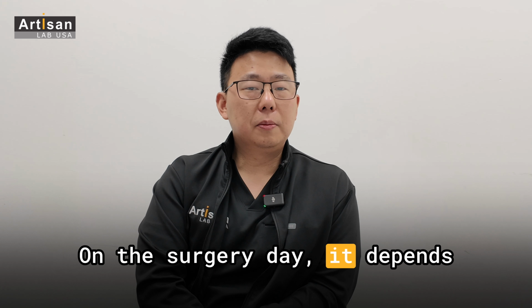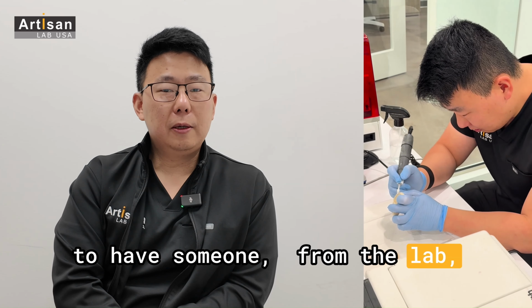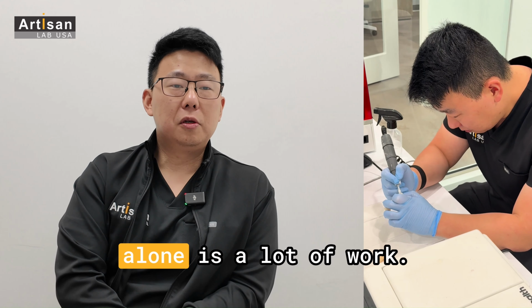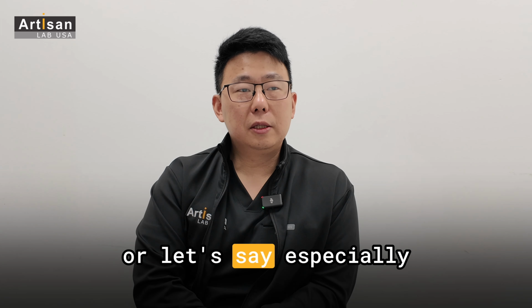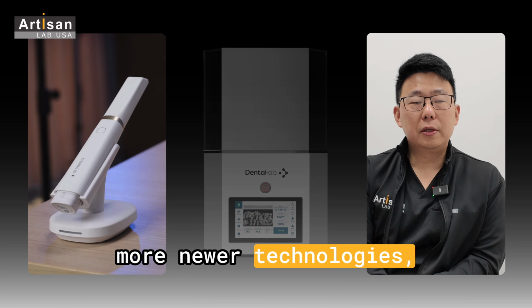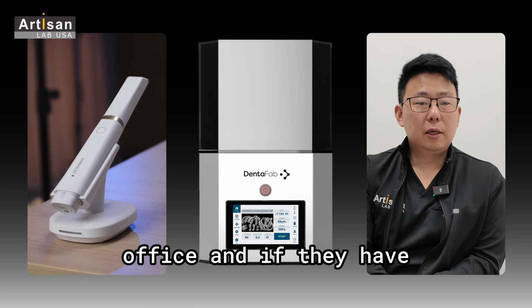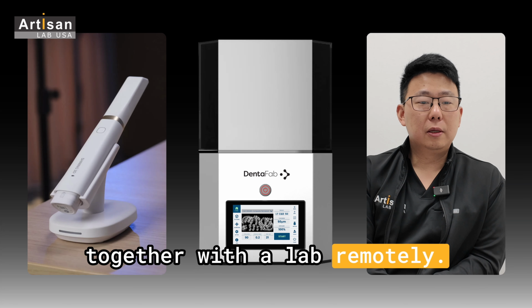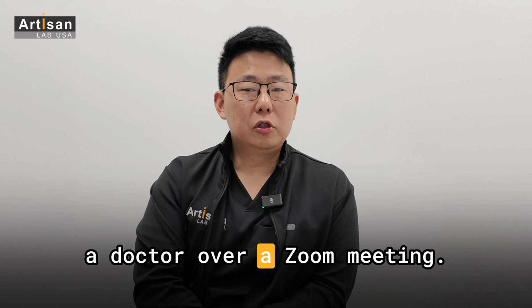On the surgery day, it depends on the doctor's preference, but a lot of doctors prefer to have someone from the lab come out on the surgery day and take care of the conversion process, because surgery alone is a lot of work. But if the doctor is confident, or, especially with younger generation doctors, I noticed they tend to buy newer technologies like newer scanners and newer 3D printers for their new office. And if they have those, then they can work together with a lab remotely, and the lab can do the planning together with the doctor over a Zoom meeting.